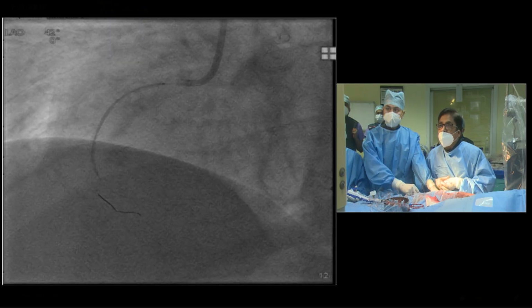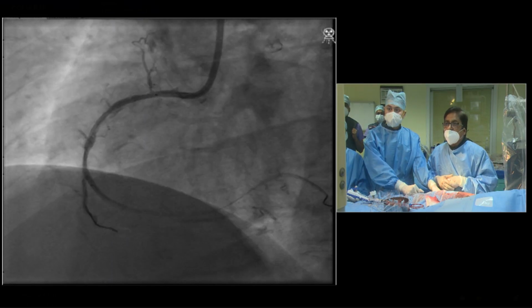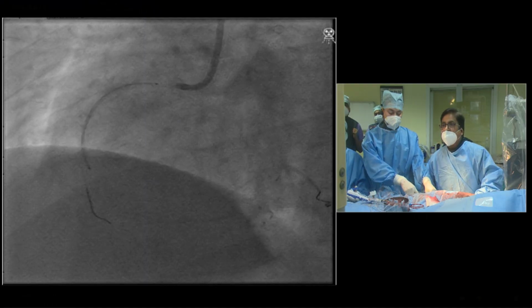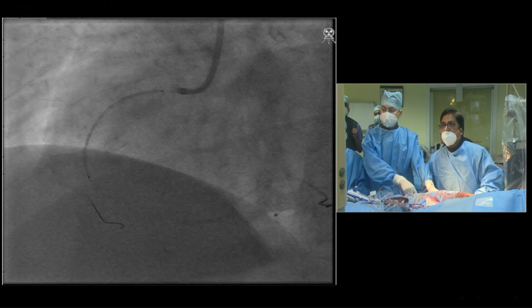Come on. One second, sorry. Angio, please, come on. Okay, we will go a little more behind. Correct. We'll have it a little more behind. Test, please.